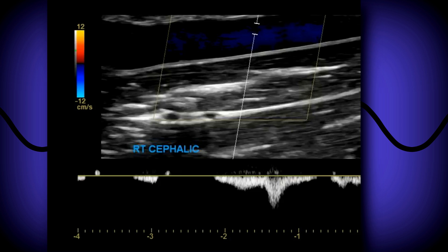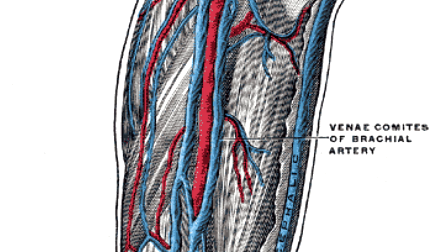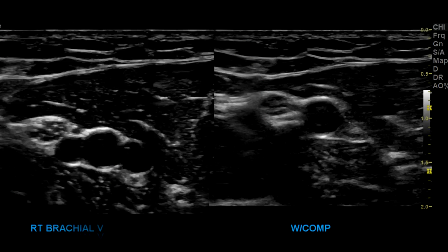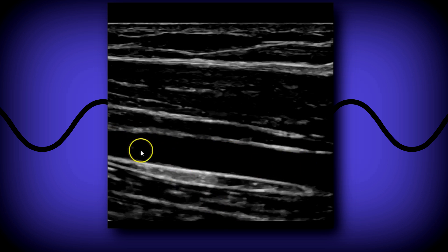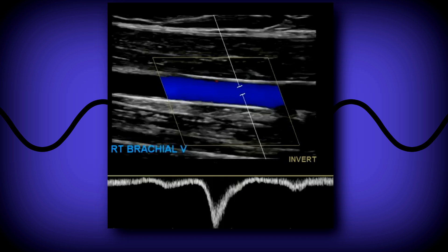Next we do the brachial veins. On this image you can see the cephalic, the brachial artery, and the two brachial veins running in parallel with it. In the transverse image with and without compression, the bigger vessel is the brachial artery and the two smaller ones are the veins; with compression the veins collapse and the artery stays open. Veins are very easily collapsible unless there's thrombus. In the sagittal view, for the protocol you can use just one vein as the identifier if there's no disease. Then sagittal grayscale, color, and a spectral waveform with augmentation.